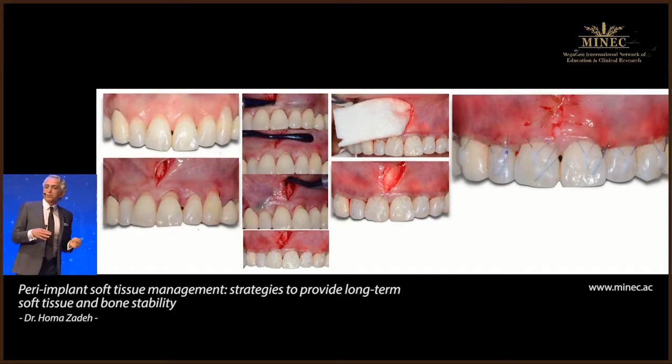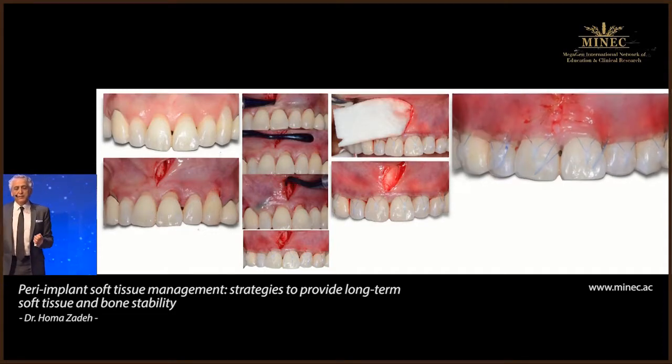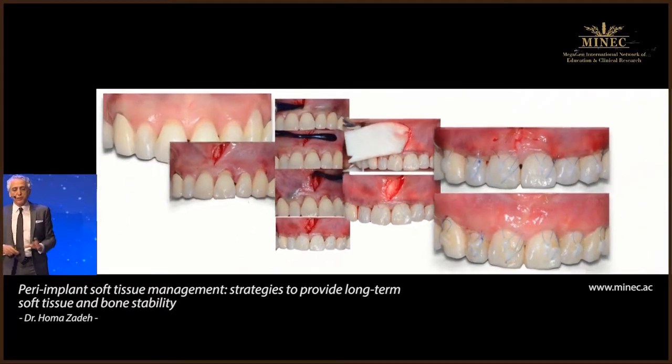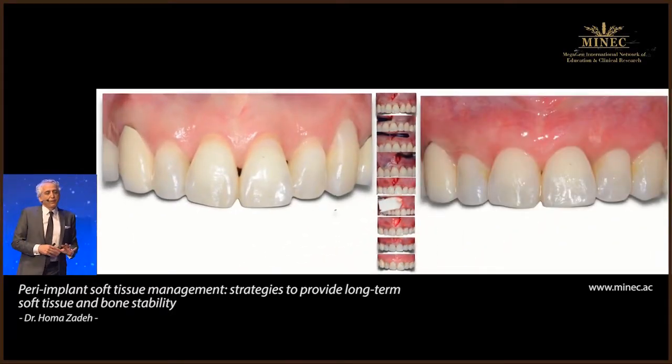And then basically closing the access, the patient comes in, and the sutures are kept in 3 weeks. And you can see that the tissue is fairly well healed by this period. And then you can see the healing. This is after 1 year, we have complete root coverage.